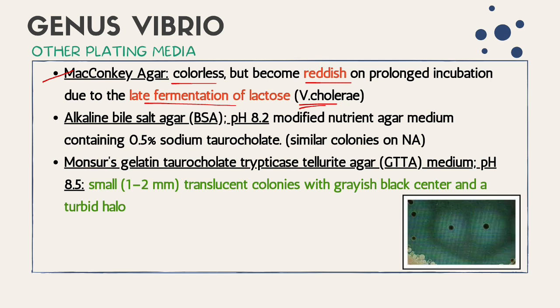Let's not consider Vibrio cholerae as a late lactose fermenter, but I just want you to know that there are books that might consider this particular organism as a lactose fermenter. For your lactose fermenter, we only have one, the Vibrio vulnificus. Later on, I will show you.